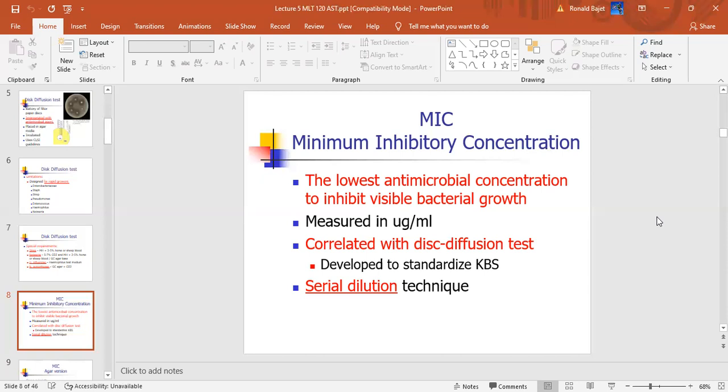Have I mentioned that to you, the 0.5 McFarland Standard? That's the turbidity standard that we have to use to make our bacterial suspension. So when you make your suspension, you need to match that. Again, that's the CLSI standard. You can't just use a tube with turbid organism and then inoculate all those tubes. It has to be a 0.5 McFarland Standard.